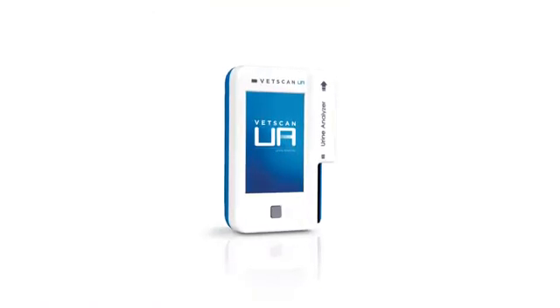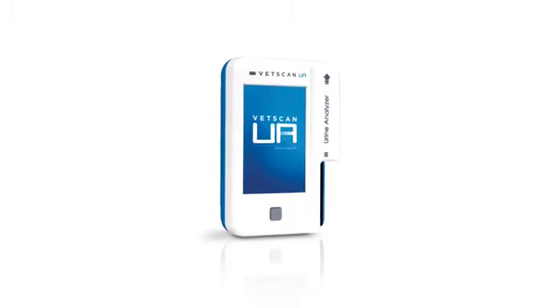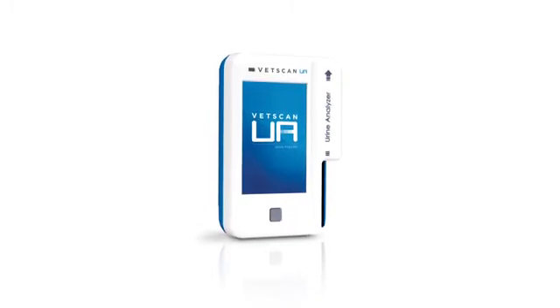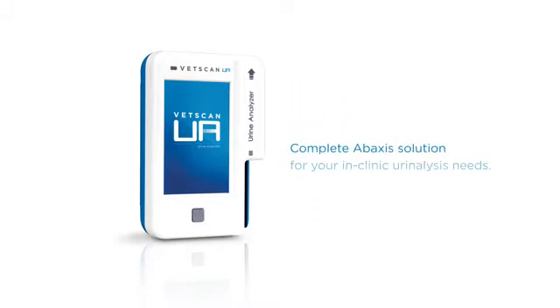The VetScan UA is the first of a two-part urinalysis solution consisting of the new Abaxis urine chemistry and sediment analyzers. Portable, reliable, cost-effective, the VetScan UA makes urinalysis chemistry testing even easier and more reproducible. It's the beginning of a complete Abaxis solution for your in-clinic urinalysis needs.